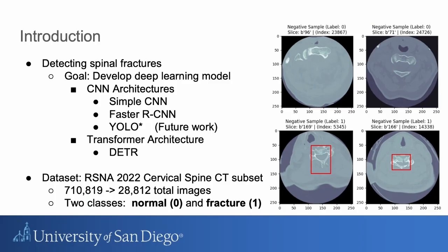Detecting bone fractures is critical in post-operative and trauma care because delayed or missed diagnoses can lead to paralysis, chronic pain, and long-term neurological complications. Traditional methods rely on radiologists and surgeons to manually interpret CT or MRI scans, which can be time consuming and subjective, varying on experience and level of expertise.